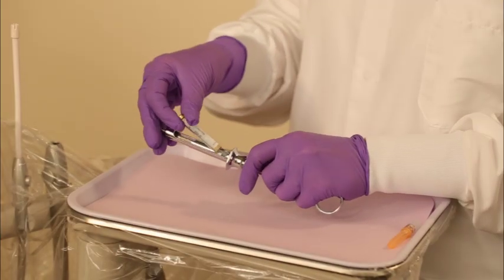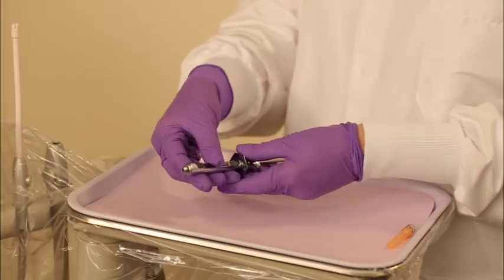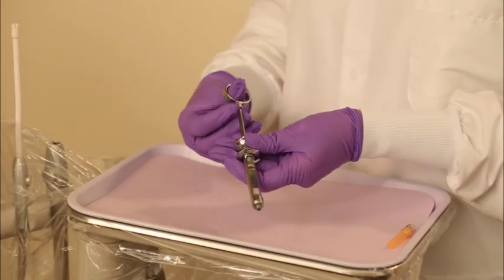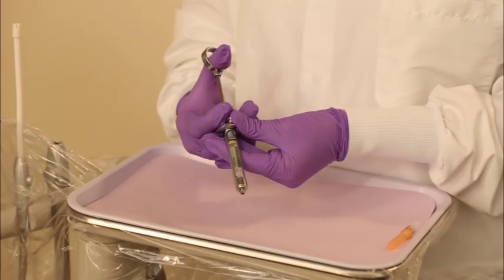Load the local anesthetic syringe as demonstrated in the procedure loading the metallic or plastic cartridge type syringe. Before injection, follow all steps as demonstrated in the procedure, basic injection technique.